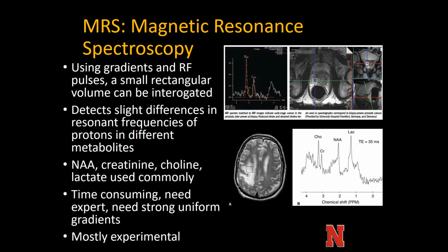It's very time consuming. It's hard to read. You really need an expert. It needs a strong uniform gradient, and it's still mostly experimental. It was used a lot for prostate cancer originally, but that's fallen out of vogue now, and I personally don't use it for anything on a routine basis.